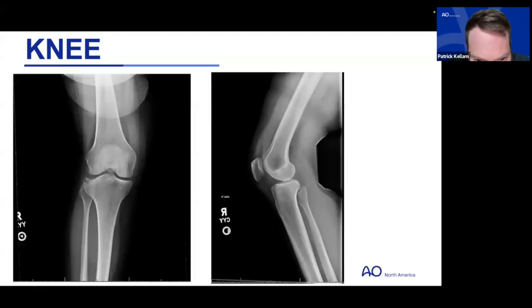The other thing, if you just go back one there, Luis, you can see the patellar tendon and you can see the quad tendon on an X-ray. We love telling patients you can't see soft tissue on X-rays, when it's convenient for us to say that sometimes, but you can. You can see a patellar tendon injury with the patella proximal and some soft tissue defect there. There's a lot of soft tissue things you can pick up on even with an X-ray.